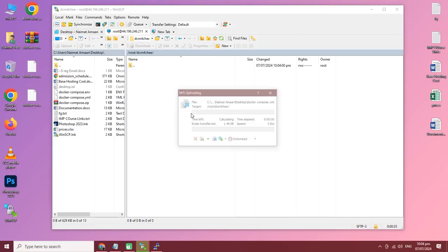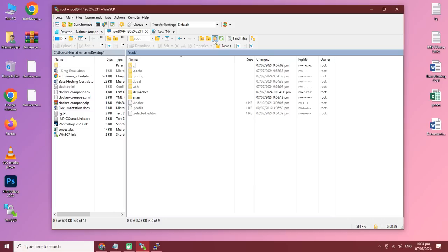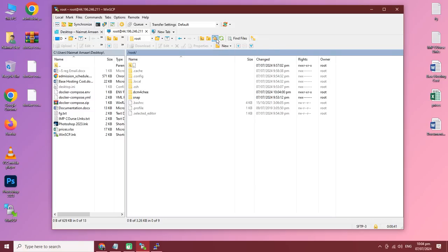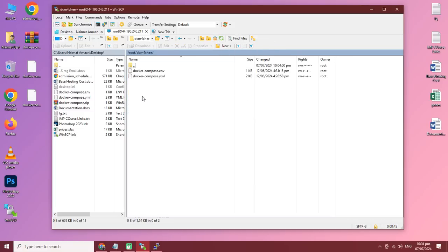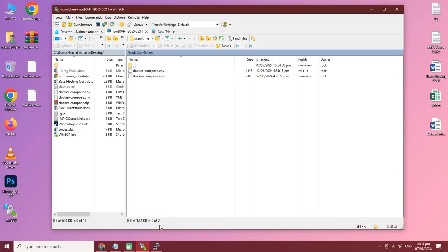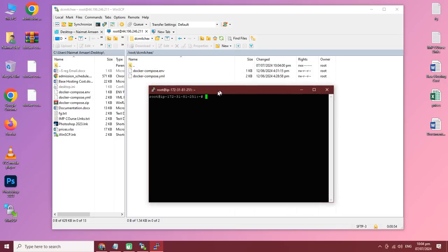This is your server root folder — keep in mind this is the root folder of your server. You need to create the DCM4CHEE folder here and just drag the downloaded ENV and YML files into it. After that, connect the server via PuTTY.